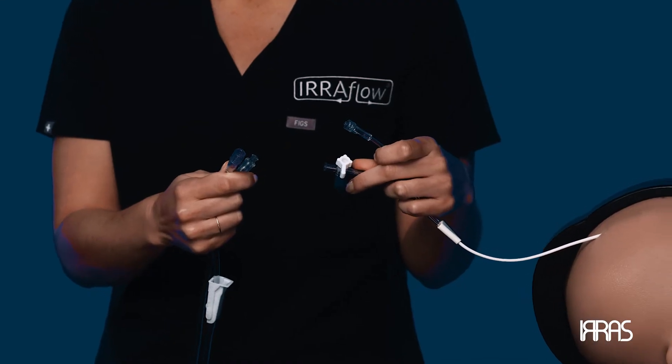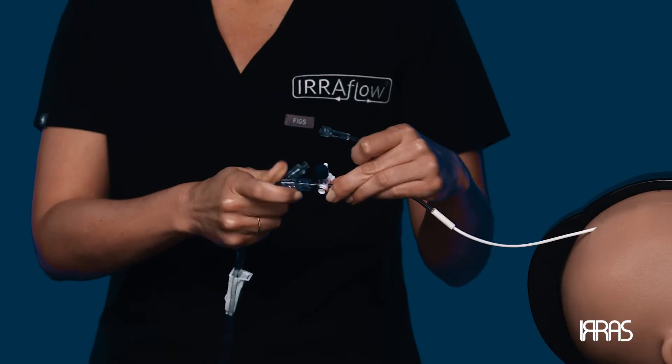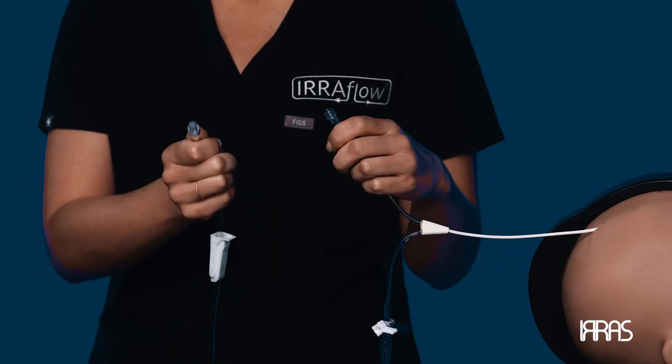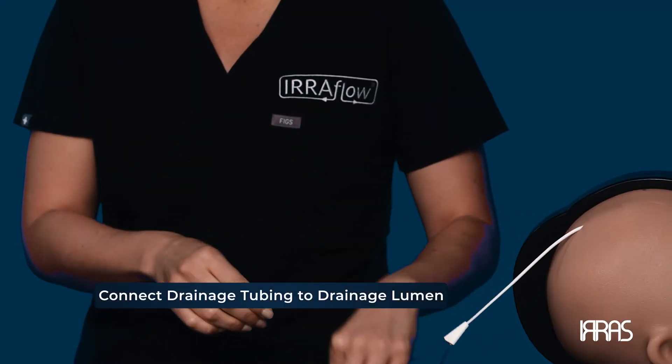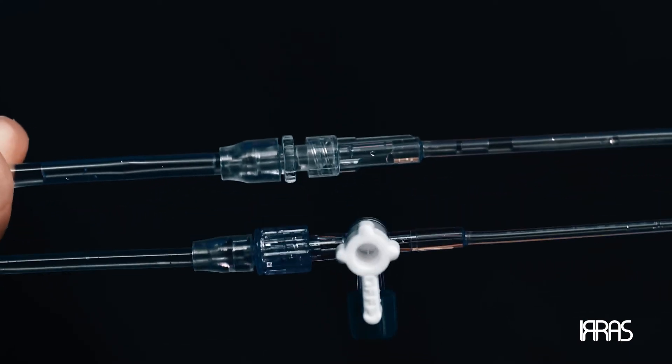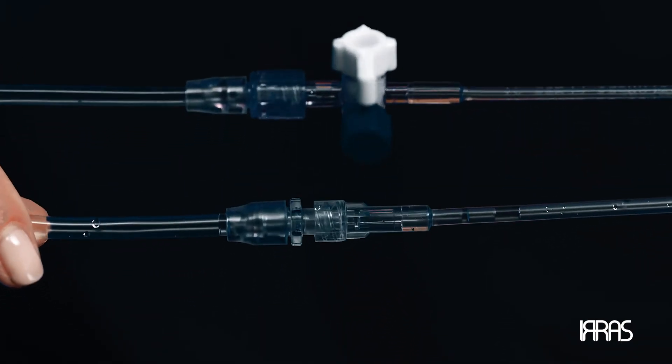You'll notice that the connection is a male-to-female connection on the Irrigation side and a female-to-male connection on the Drainage side. Then, attach the Drainage tubing to the Drainage lumen on the catheter. The differences in connections ensures the appropriate tubing is connected to the correct catheter lumen.